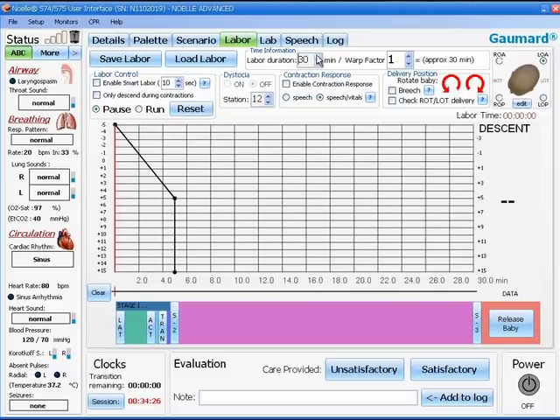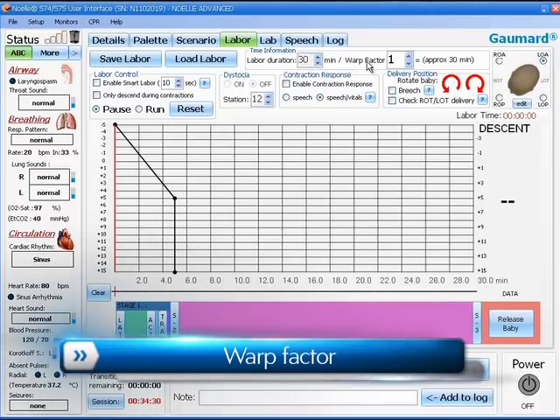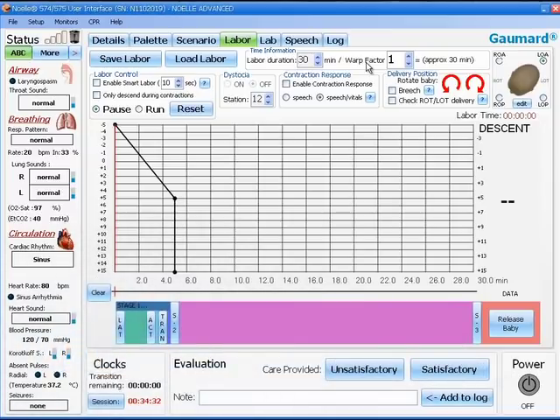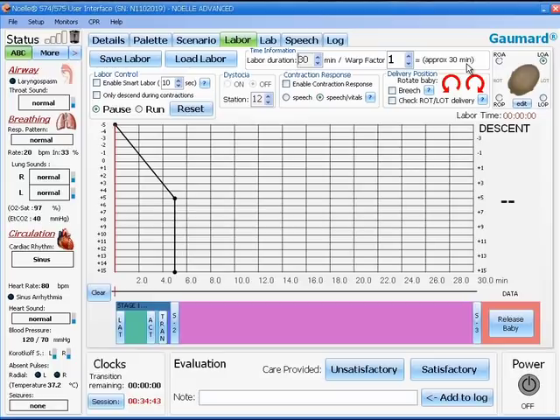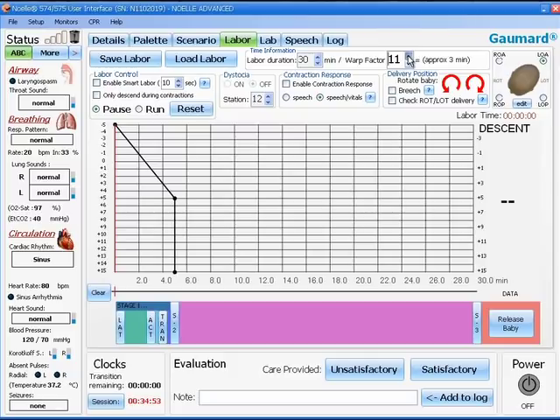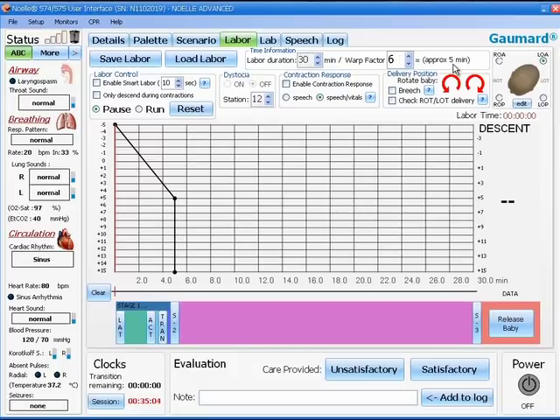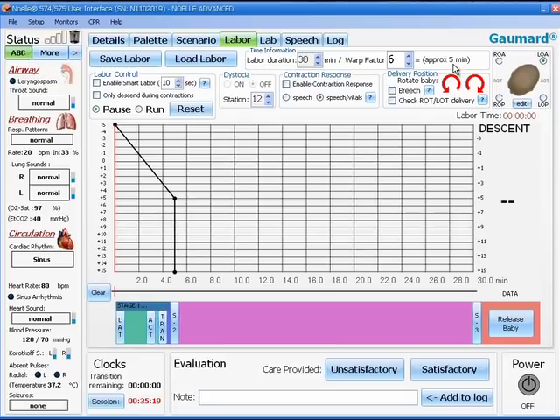The other side of the hash mark shows a box labeled warp factor. A warp factor of 1 means that the scenario will take approximately 30 minutes to run a 30 minute labor. If we click the two arrows to the side, you'll notice that you toggle between 6 and 1 in the warp factor window. If I go up to 6, that means that the scenario will run 6 times faster. Then the 30 minute scenario will complete in approximately 5 minutes. You may also use the warp factor as a fast forward during a scenario, and you may toggle between speeds at any time during the labor.